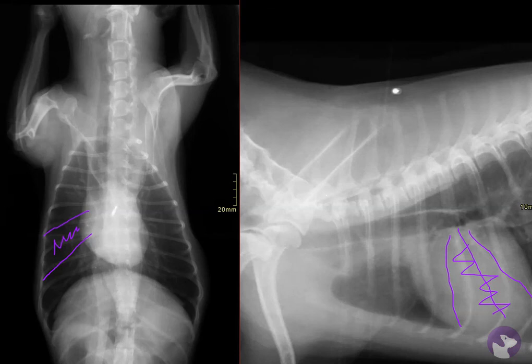So that's megaesophagus in this patient without any evidence of aspiration pneumonia. Our next step might be to do a swallow study, try additional medical management, or do endoscopy. I think what we really need to do is consult with an internal medicine specialist who might help us further with the case.